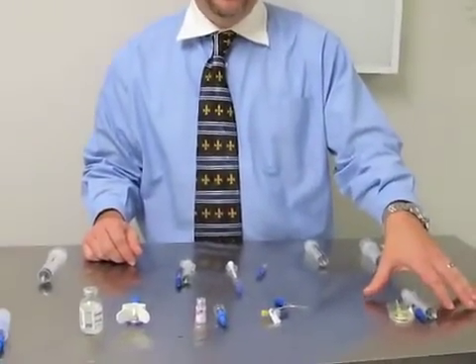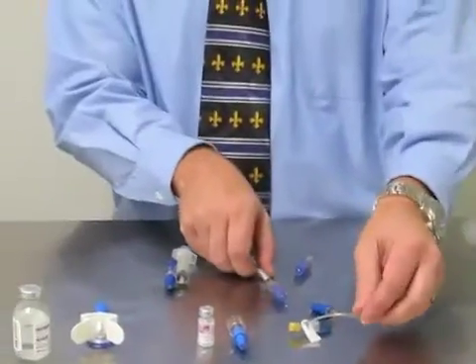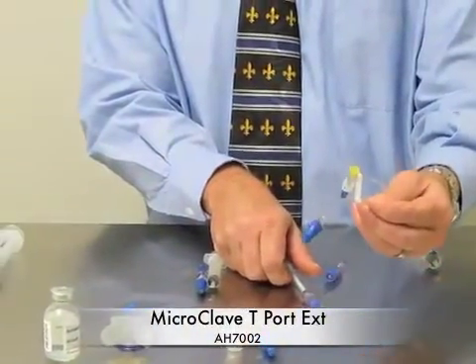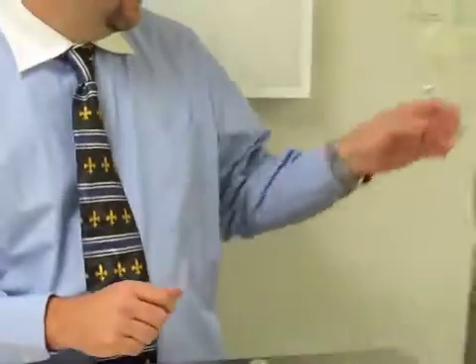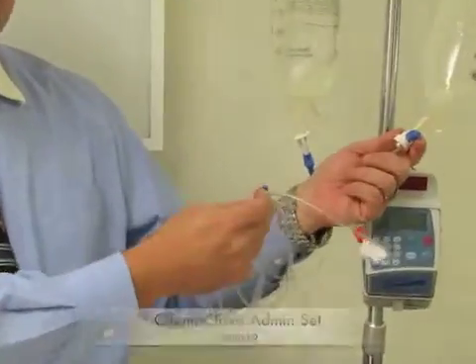Basically, there are three ways to deliver chemotherapeutics. One is IV push via a winged infusion set. We can also do direct IV push via IV catheter and a T-port set. Or we can do a constant rate infusion via an admin set.